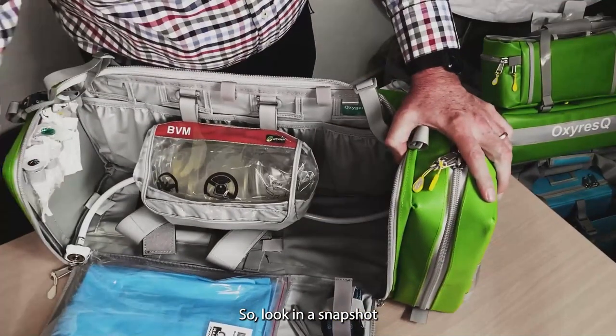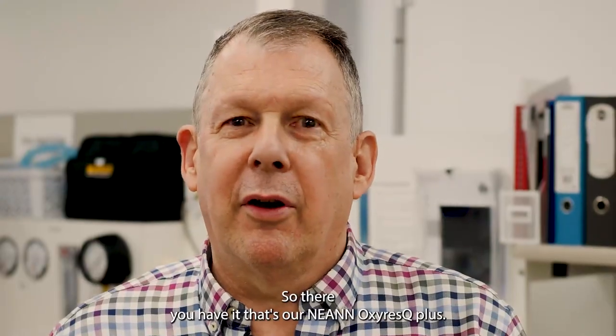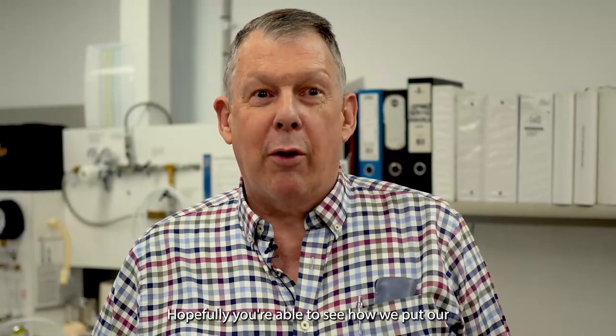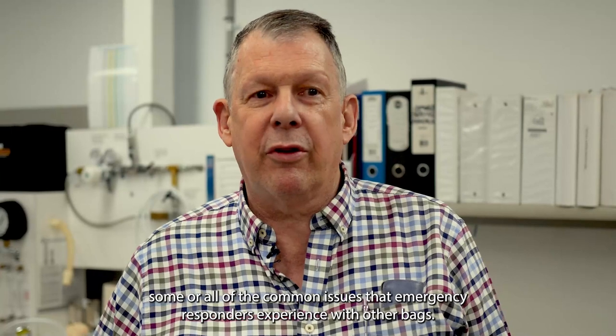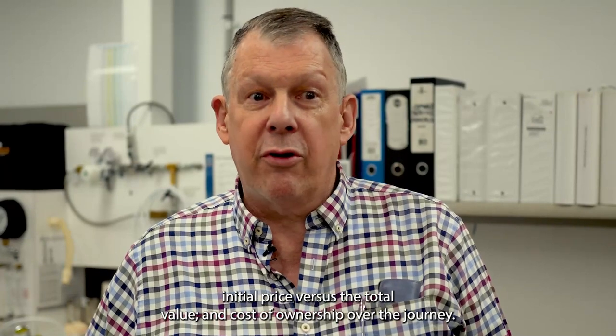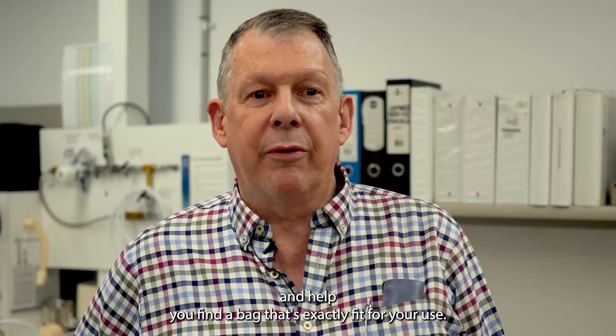In a snapshot, that's our NEAN Oxy Rescue Plus — a fantastic bag and one of our biggest, with the ability to carry the most stuff. Hopefully you can see how we've put decades of design experience into developing a bag that addresses common issues emergency responders experience: organisation and layout, chaos versus calm, initial price versus total cost of ownership, and OH&S and environmental concerns including environment-free antimicrobial fabric. The NEAN team at RAP Australia would love to help you find a bag that's exactly fit for your use. Give us a call or send us an email — we'd love to hear from you.